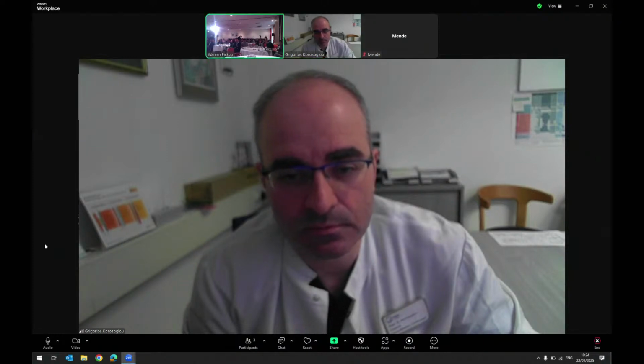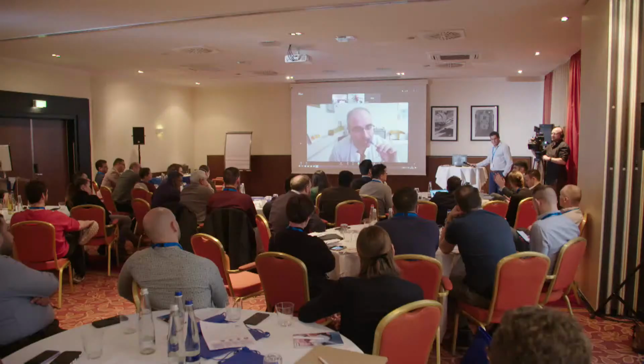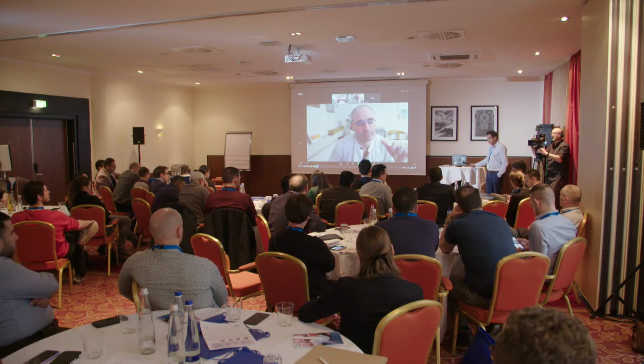I think that's an important distinction to make, isn't it? Understanding what's recoil, what's residual stenosis, and what is a dissection. For me, that's where IVUS really helps give you that insight, because each one of those is managed in a different way. And spasm as a fourth one. All these 4 things can look exactly the same on an angiogram, but they all have a very different way of managing them. So trying to differentiate between those is pretty much the challenge in treating tibial disease.